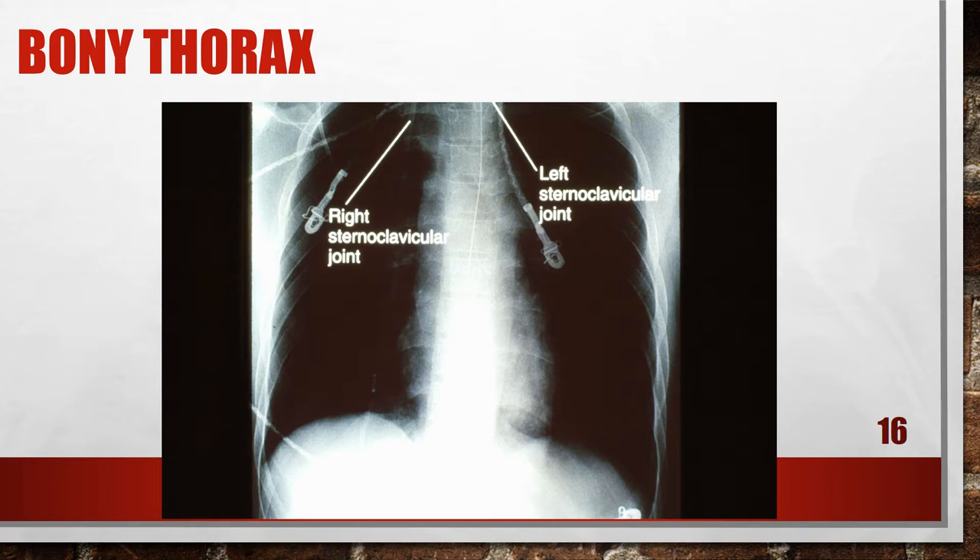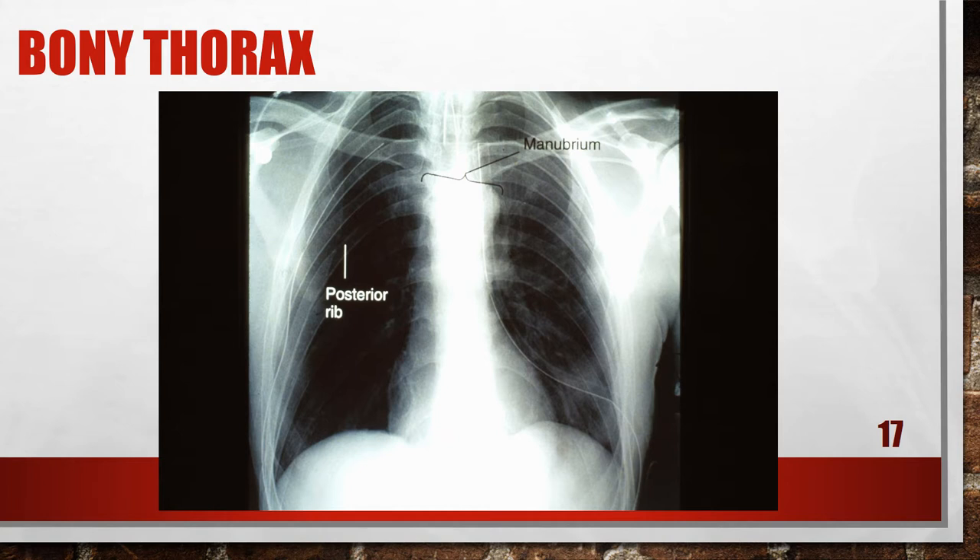This is an AP chest x-ray where the apices are cut, one of the costophrenic angles is cut, and if we could see the sternoclavicular joints, we would definitely see that the patient is rotated. This is another AP chest x-ray where the apices are cut, but we also have a central ray that is angled caudal — I know that because the clavicles are being shown below the apices and the ribs look squared off. The central ray was angled too far caudal, toward the feet.